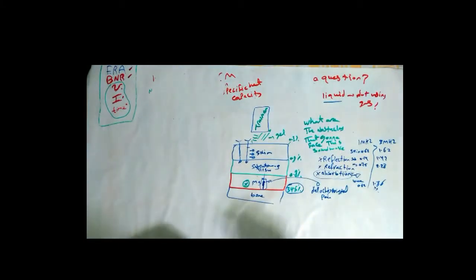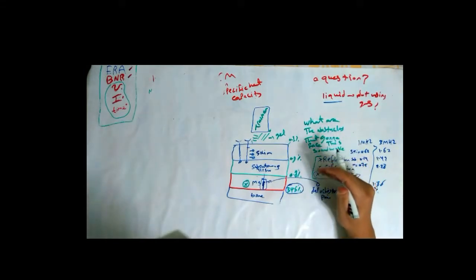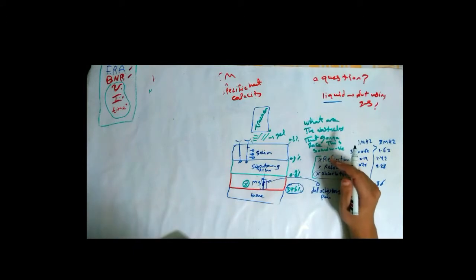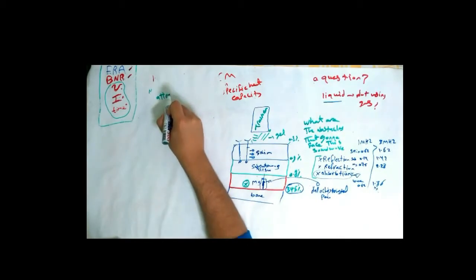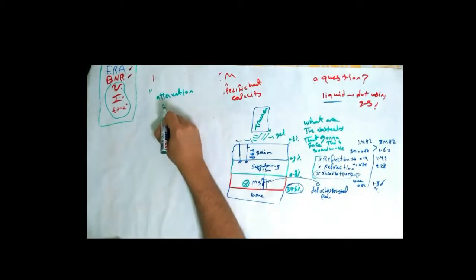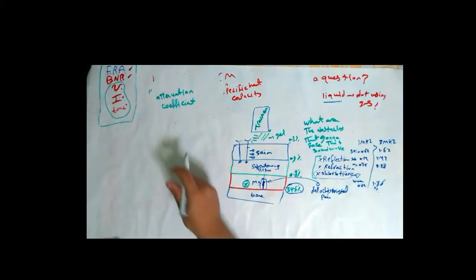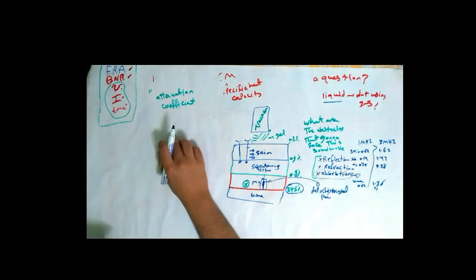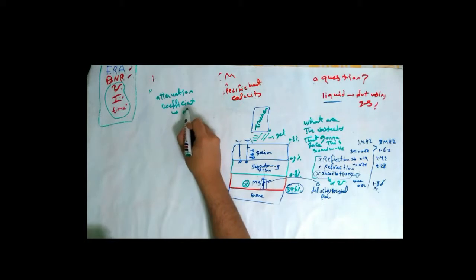Finally, we call all these obstacles that the sound waves will face, which make the sound lose some of its energy, the attenuation coefficient. It is a measure of the energy loss when sound propagates in a medium. Since absorption is one of the obstacles, and absorption is in direct relation with frequency, the attenuation coefficient will also be in direct relation with frequency.